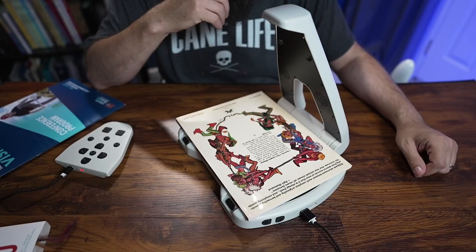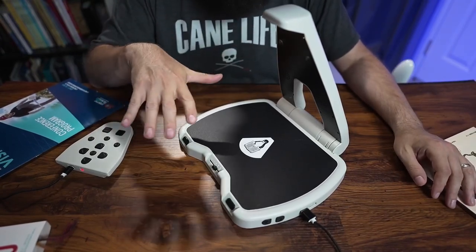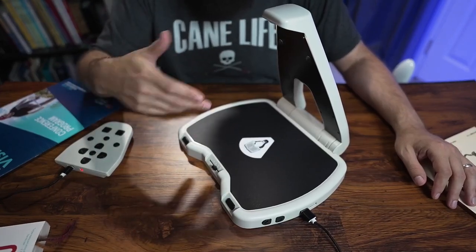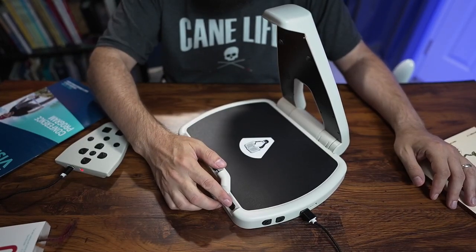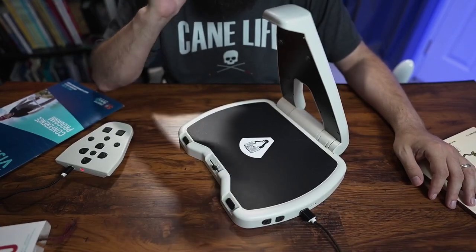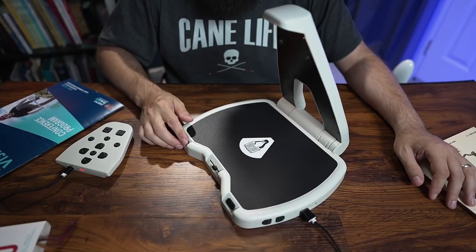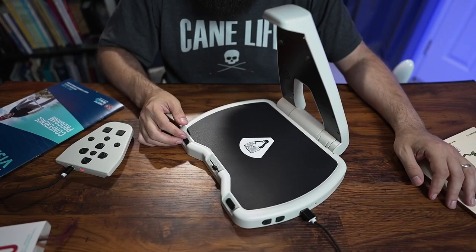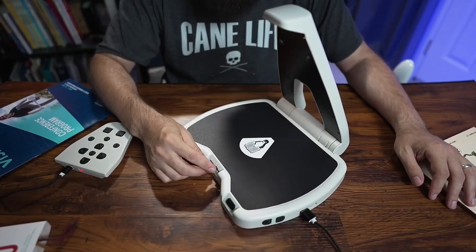The device reads: "Elfquest alternates between such complete originality and borrowing eclectically from several sources at once, that it is always fresh and completely avoids the staleness that has tainted almost all recent fantasies." Now I can remove it — when I remove the document it prompts me to place the document again, but it's still holding that image in its memory. I can press the play button to continue, and the left button on the front takes me back a sentence. We also have our volume control.